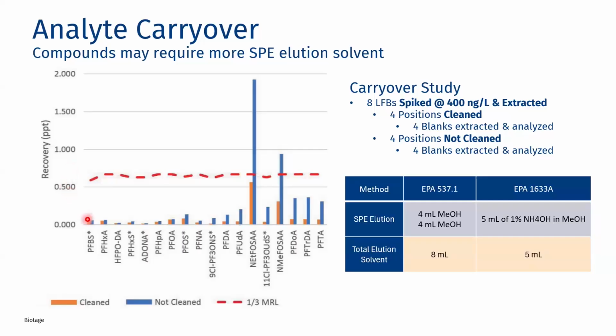And you can see all of those blanks are below the 0.5 nanograms per liter. And when we didn't clean it, you can see we had some hits that were over 1/3 the MRL. And sure enough, it was NetFOSAA, and even NMeFOSAA.